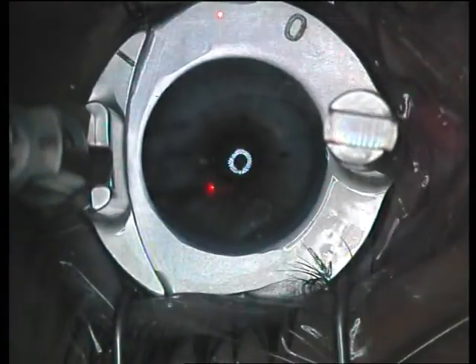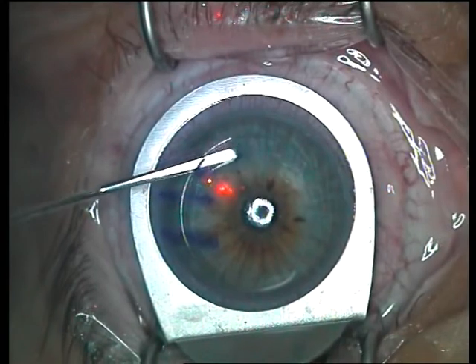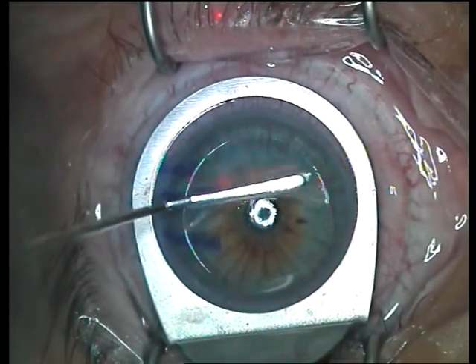The microkeratome head is placed on the cornea, locked and advanced. It is now reversed off, unlocked, and removed off the ring. Suction is now stopped and the ring is removed off the eye. The flap rest is placed on the eye.